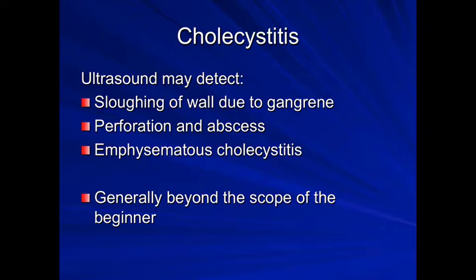One thing I will mention is that because you may well have a layer of sludge in the gallbladder due to stasis, distinguishing that from the wall that has sloughed off can be very difficult, and so I'd be cautious in overdiagnosing gangrenous cholecystitis when you begin scanning.